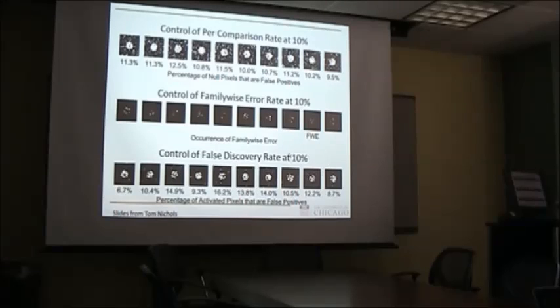And the important thing to recognize is these values are identical. So basically, controlling for the family-wise error rate or using a false discovery rate at the same level leads to a different outcome. And it's usually the case that the false discovery rate is a more lenient way of correcting for these multiple comparisons than the family-wise error. And again, even disregarding the details of how these methods work, it's important to realize that if you're looking at your results tables from SPM, it might be the case that something is significant with an FDR correction, but not with a family-wise error correction.